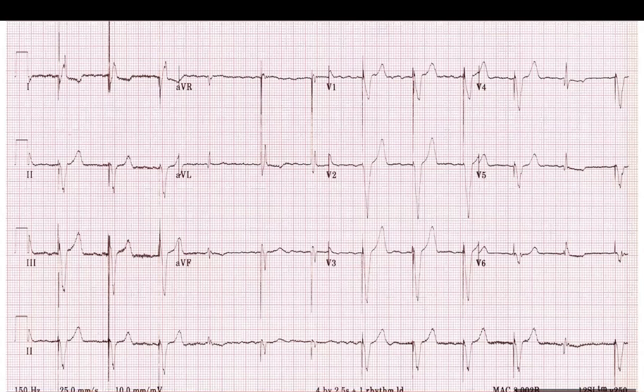Maybe it's malfunctioning or failure to sense. So failure to sense, explain it to me a bit, I didn't understand what you meant by failure to sense. It means that once this intrinsic QRS came, it was not sensed by the pacemaker to be paced. Okay. I'm not sure you understand it correctly and you're able to say it.